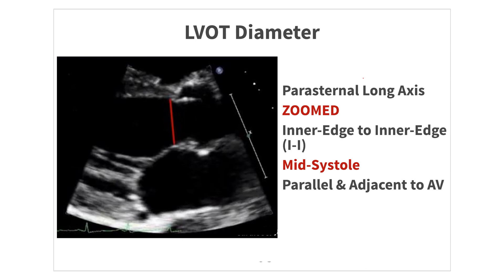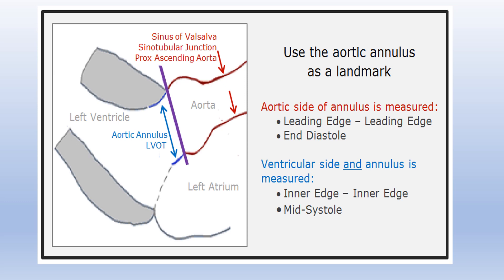The LVOT diameter is measured in the long axis view, in B-mode, from inner edge to inner edge, in mid-systole, and parallel to the aortic valve annulus. Here is an important tip: this is the aortic annulus. Everything towards the ventricular side is the LVOT diameter, and this is the site of LVOT diameter measurement.